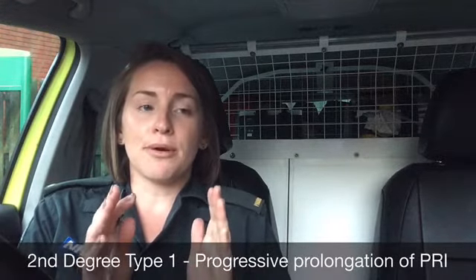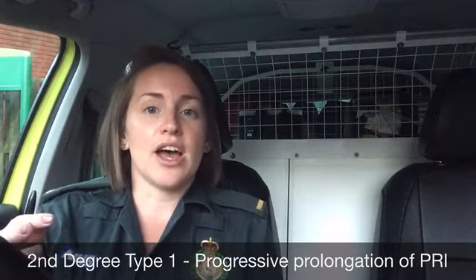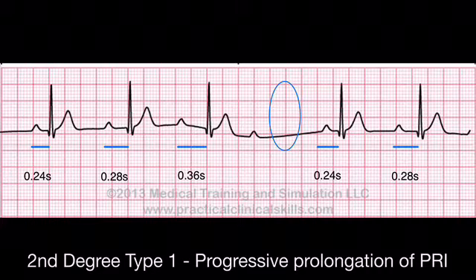Moving on, you've got second degree. Within second degree, there's second degree type 1 and type 2. So second degree type 1, again we go back to the P to QRS relationship. There's a progressive prolongation, so they're getting further and further apart, and then eventually a QRS drops, or it's absent. It looks like it should be there and it's just not there. What this is, is progressive fatigue of the AV node. It's getting tighter, tighter, tighter, and then it fails to propagate the depolarization. What you'll commonly see after that is the next PR interval will be the shortest one, and then it gets longer and longer and goes from there. So that's second degree type 1.